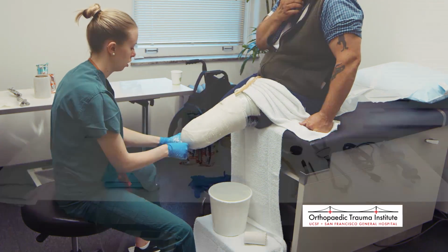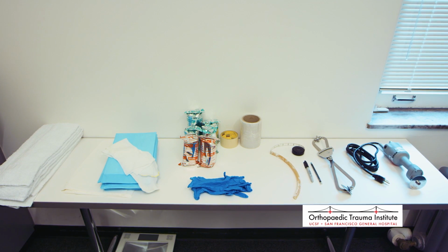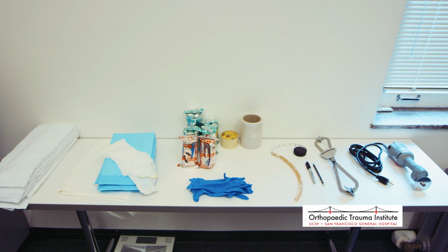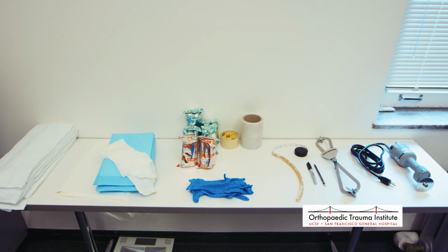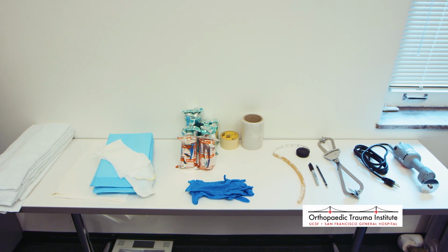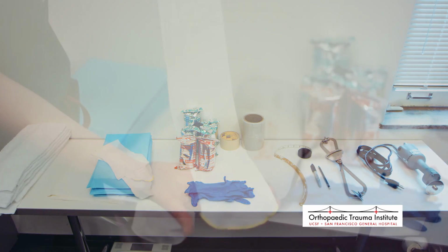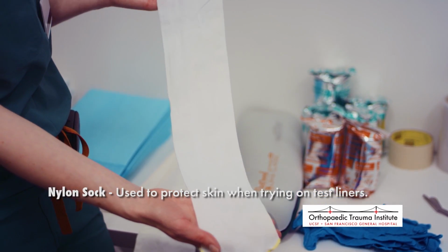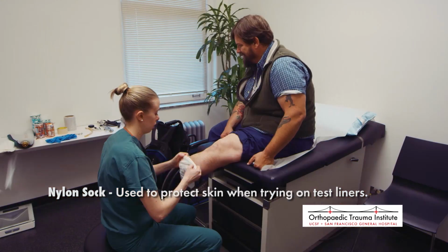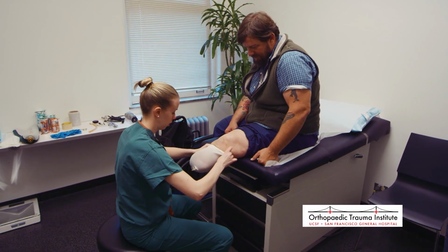On this table we have all of our tools set up to prepare for casting. This is kind of the spread you would see if you were to come for a casting appointment. The first thing here, this may or may not apply to everybody, but this is a nylon sock, just a basic sock. It's really elastic and stretchy. We'll use it as a barrier to your skin just when we're trying on test liners.